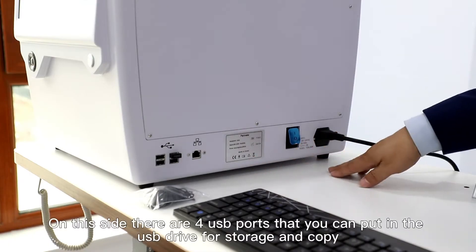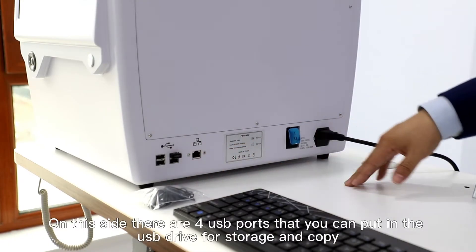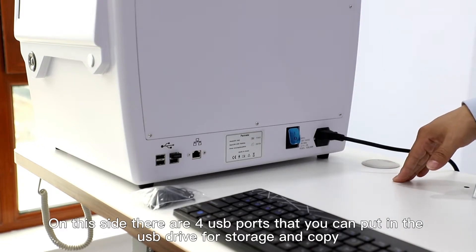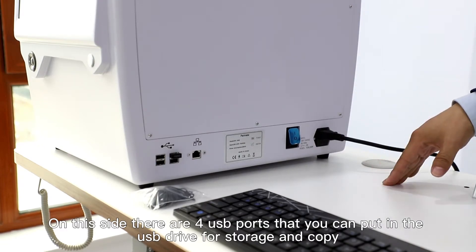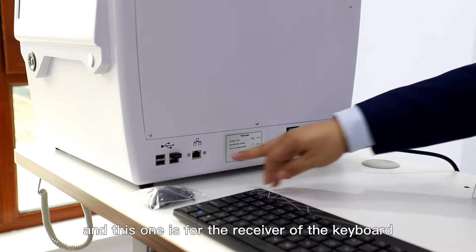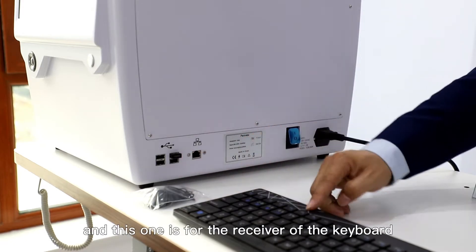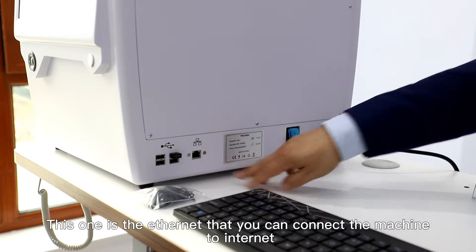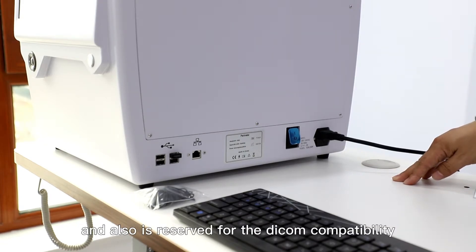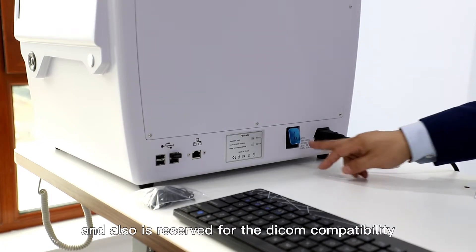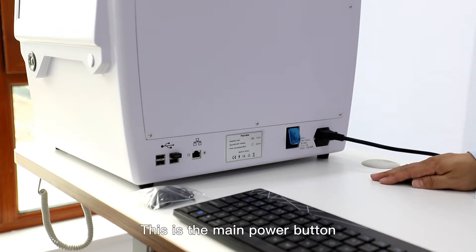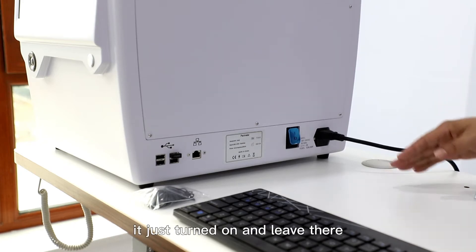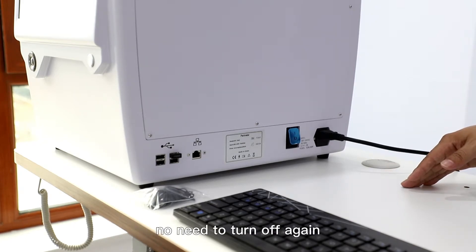On this side there are four USB ports that you can use for storage, copy, and data transfer. This one is for the receiver of the keyboard. This one is ethernet that you can connect the machine to internet and is reserved for DICOM compatibility. This is the main power button. Once it's set up, just turn it on and leave it there, no need to turn it off again.